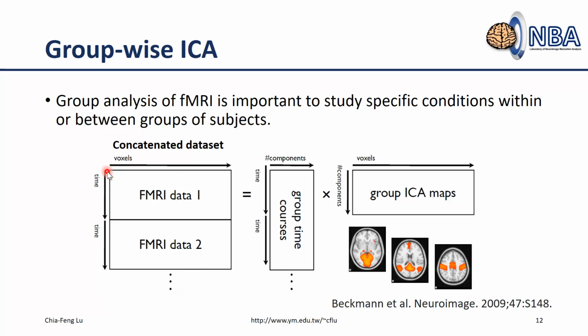So you can see the first part is labeled as fMRI data 1. That means the fMRI data set from the first subject. And as you can see here, we didn't put the original fMRI data in this matrix. Actually, we reformed the matrix. You can see the rows represent the time points. For example, we collect the motor task fMRI data for maybe 200 volumes there.